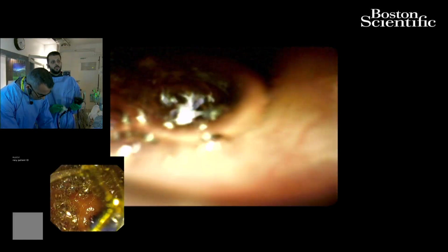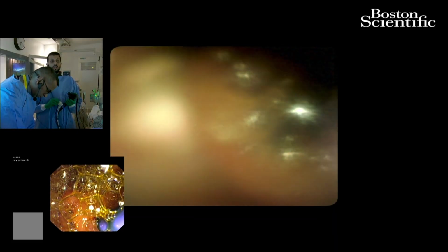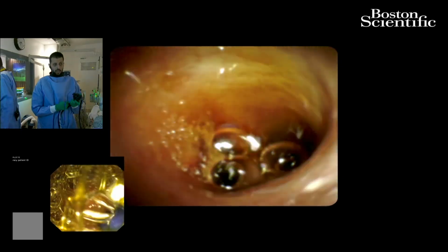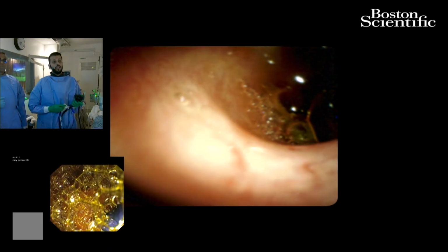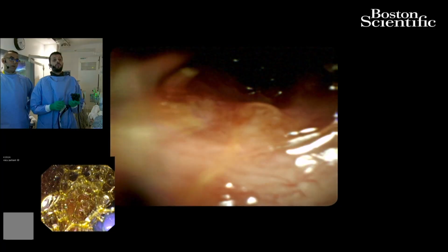So as you can, can you guys hear me? Yes, we do. Actually, we did the standard ERCP first. There were 2 plastic stents that were removed, and then we did a cholangiogram, and there was a very short stricture at the common hepatic duct. What's interesting, Dr. Imad pointed out that it's right next to the cholecystectomy clips on fluoroscopy. I don't know if you guys can see the fluoro or not. But we're examining the bile duct, and Dr. Imad, can you identify any stricture here or any abnormalities?